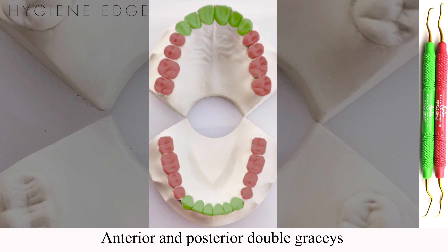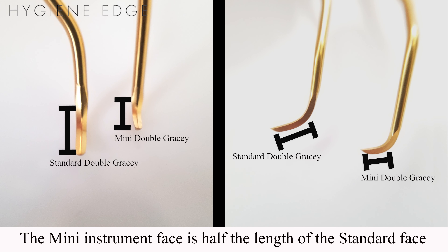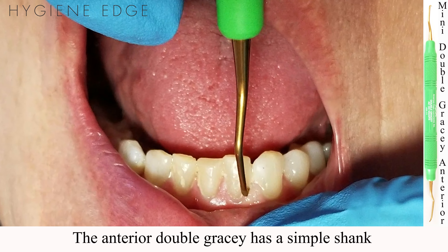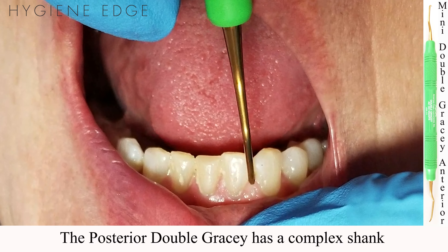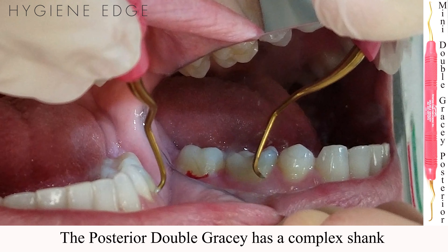These are the XP Sharpen Free Double Gracie Minis for anterior and posterior teeth. The terminal shank is 3mm longer and the instrument face is half the length of a standard Gracie, allowing for additional ease of access in furcations and narrow tight contacts. The anterior Double Gracie Mini has a simple shank for anterior access, and the posterior Double Gracie Mini has a complex shank allowing for access of the posterior teeth.